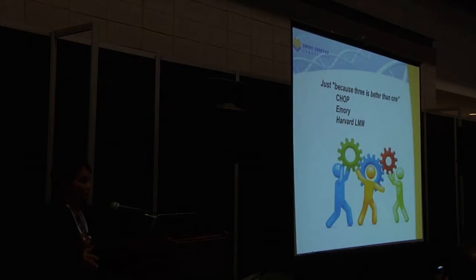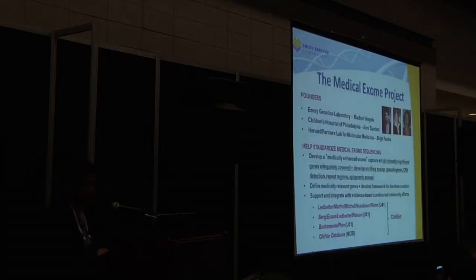So essentially, I started this in early 2012 and then joined hands with Birgit Funke at LMM and Avni Santani at CHOP. And we decided that if we get together on this project, we can probably do better. So this is a medical exome project, and the idea here is we set out to design a clinically or medically enhanced kit for genes known to be associated with disease, but we are also developing assays for pseudogenes, genes with pseudogenes for CNV detection, and I'm going to talk later about that in the OGT exhibit theater, repeat regions, and the epigenetic assays as well.